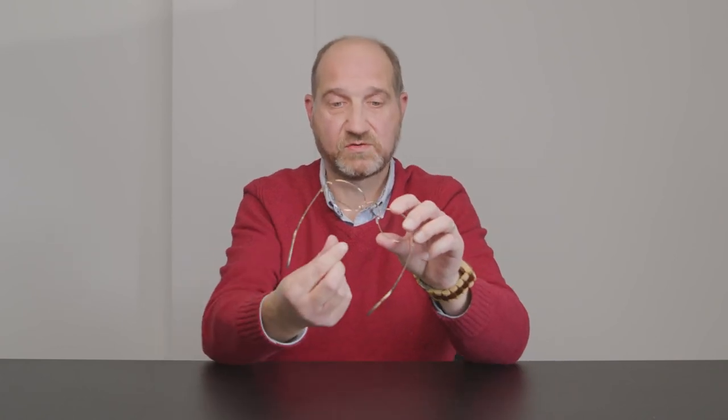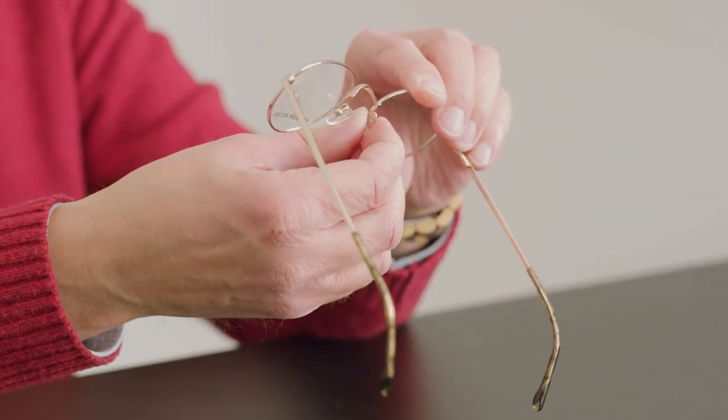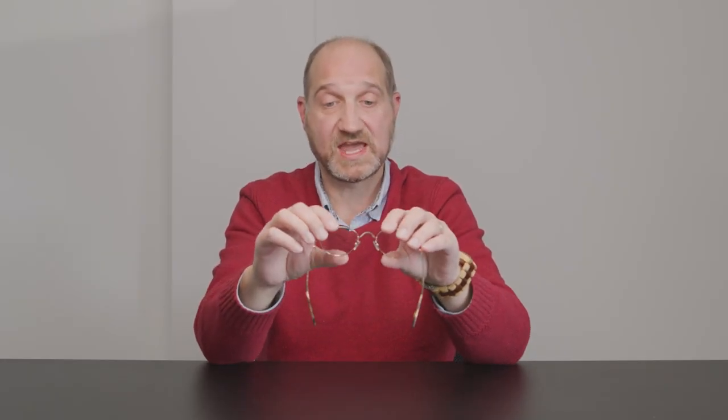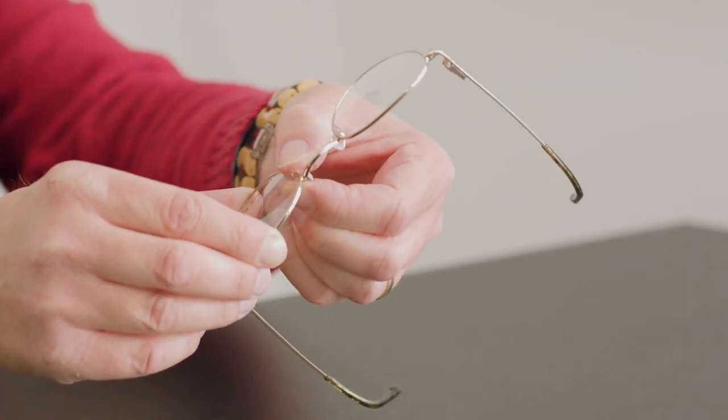Narrowing the pads is just as easy as widening them. What this can do is make the pads sit a little bit tighter on your nose, to make the glasses sit a bit higher and to stop them from moving around quite so much. Holding the glasses with one hand, grasp the nose pad with finger and thumb of the other hand and just gradually, gently and firmly move the pad inward slightly. Do the same on the other side with the opposite hand, just to move it in slightly.